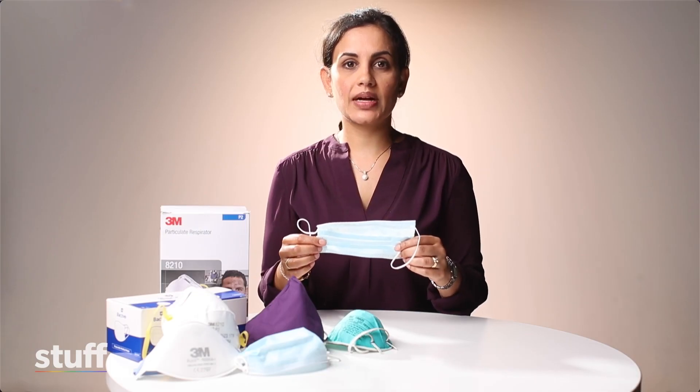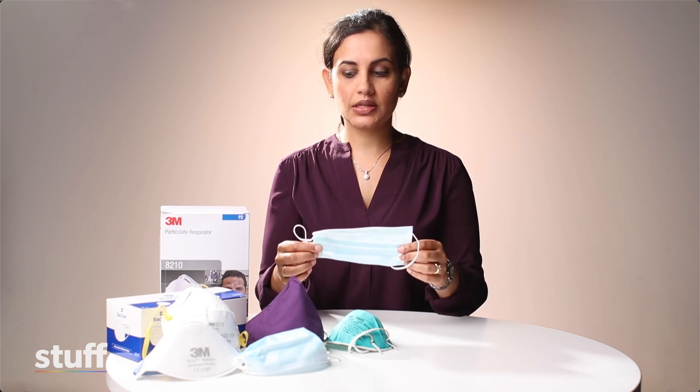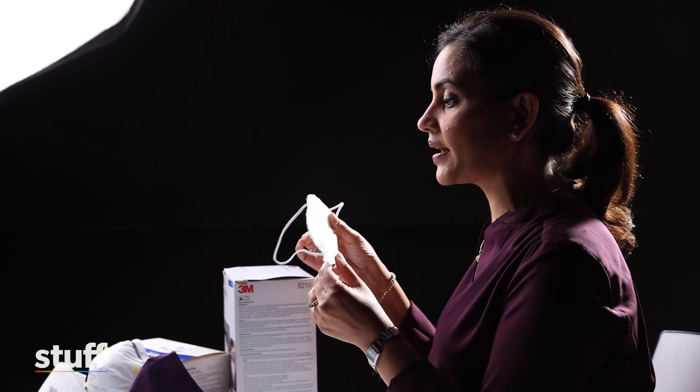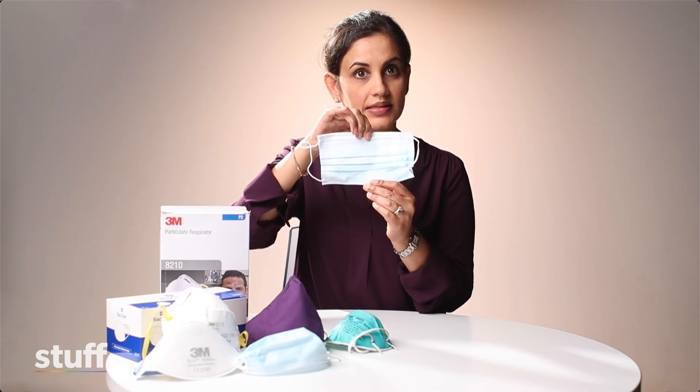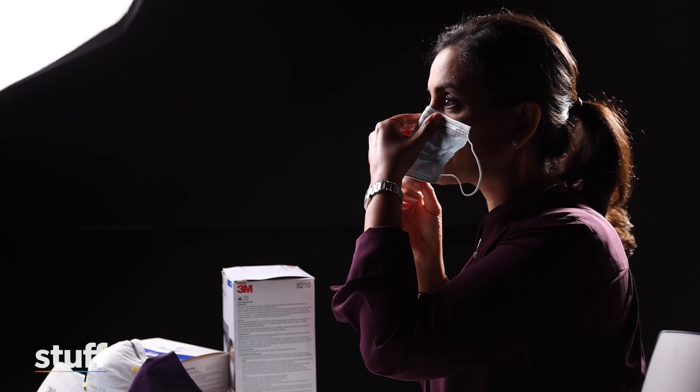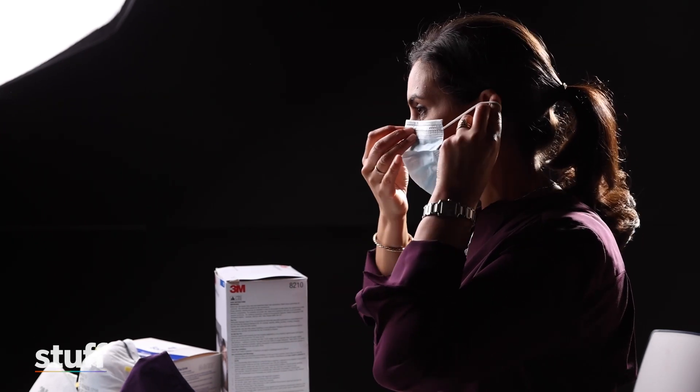When you're putting on a surgical mask, make sure your hands are clean first. Take your surgical mask and make sure that the coloured side or the blue side is facing outwards, as that's the waterproof layer. Make sure that the wire side is at the top, which is the side that moulds to your nose, and then place it over your face. Fan out the pleats to cover under your chin and put the hooks over your ears.